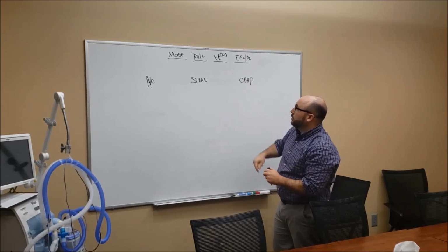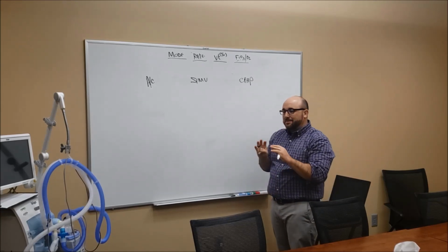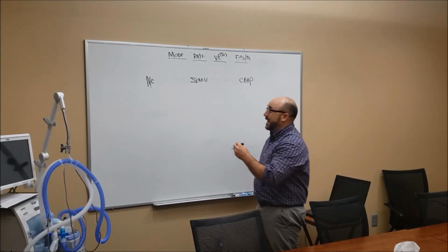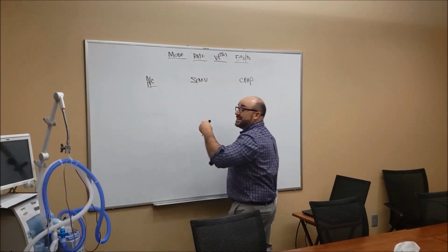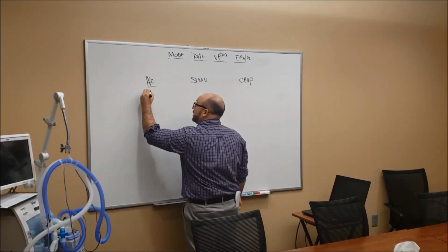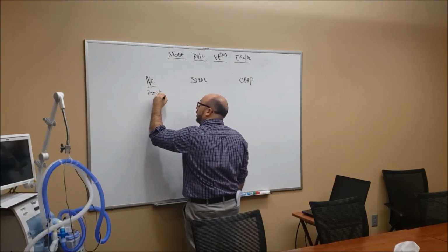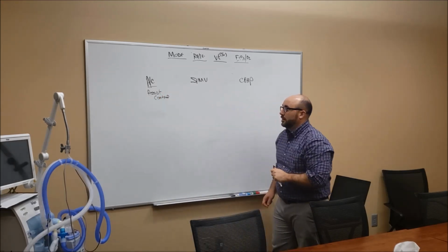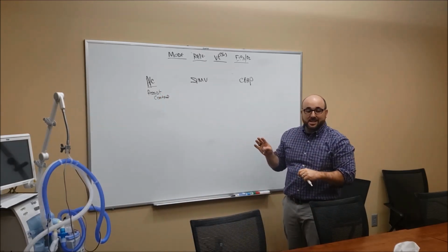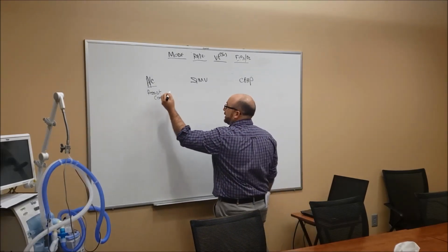So the first thing when you give a report, you're going to say what mode they're in. The vast majority of the time, your patients are going to be in AC. Does anybody remember what AC stands for? Assist control. Exactly like it says, it explains what the machine is doing. It's assisting, but it's also in control.